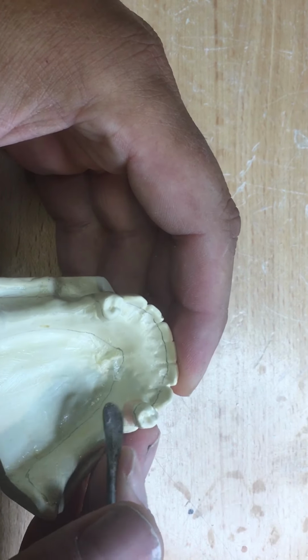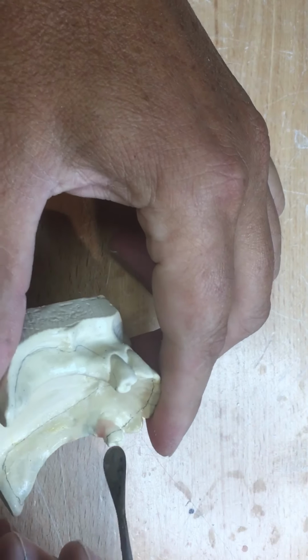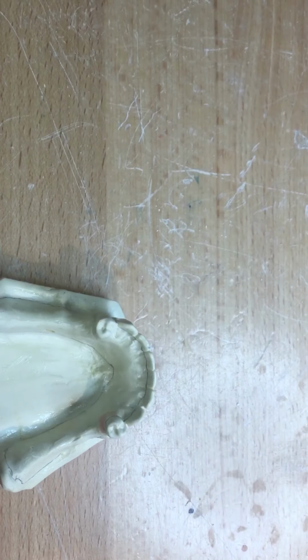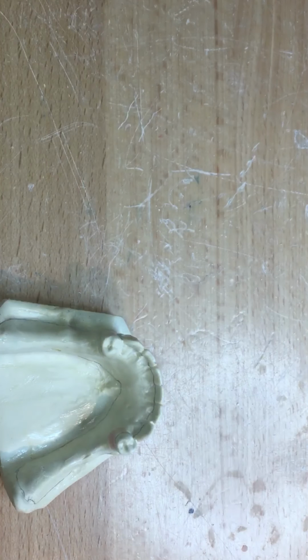You can block these undercuts out. The problem is, if we use this block out material a little bit too liberally or too much, then the base plate becomes really non-retentive or doesn't sit positively or is less accurate to the model. If this is less accurate to the model, then we're going to have, again, inaccurate registrations.